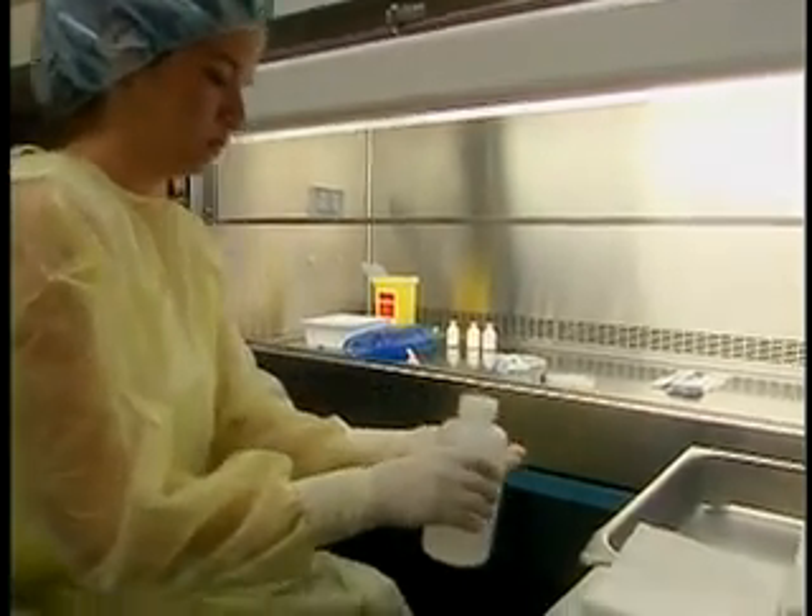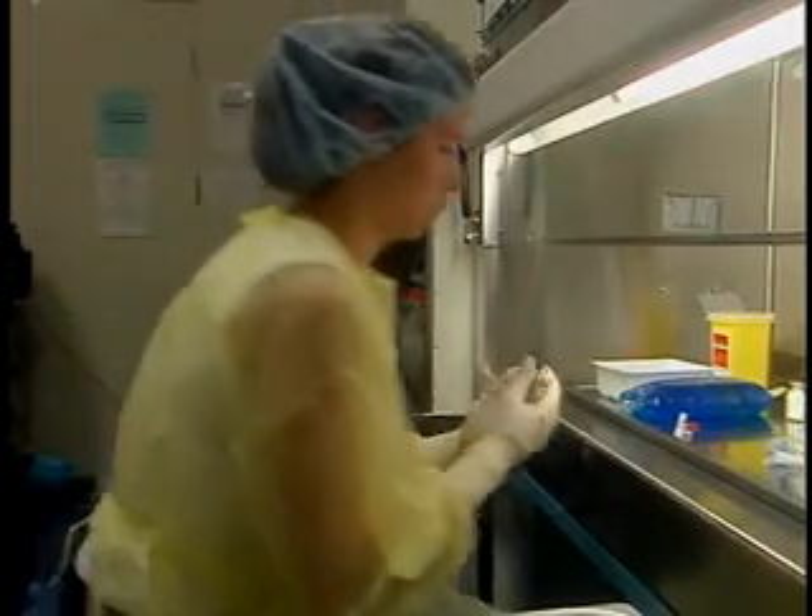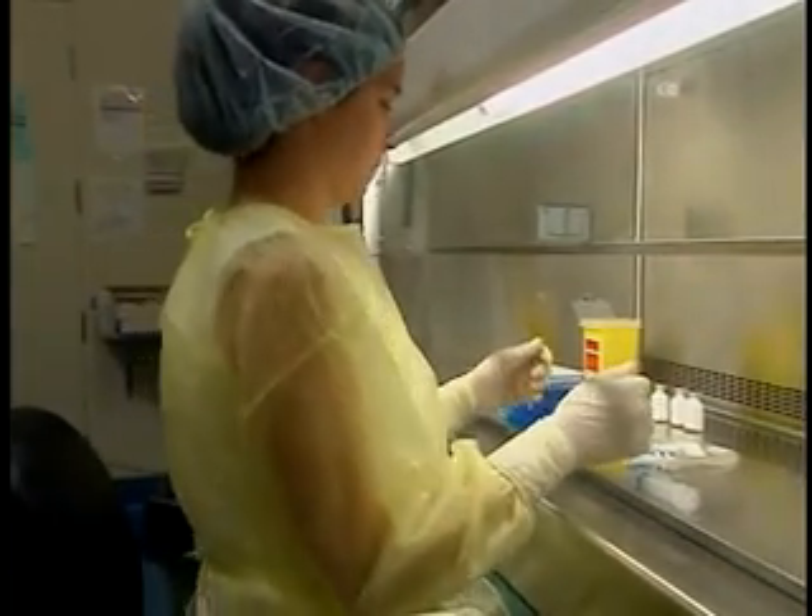Rub 3 to 5 ml of alcohol on your gloved hands and let it dry completely. Sit down at the hood to begin the manipulations. Reposition your supplies according to the order in which you will perform the work, making sure not to disturb the laminar airflow.